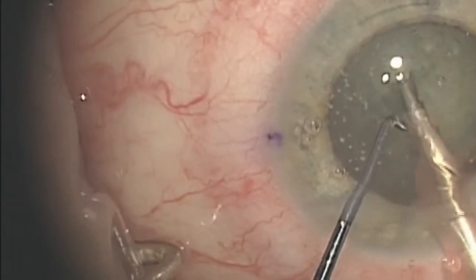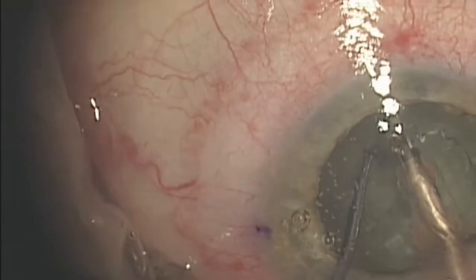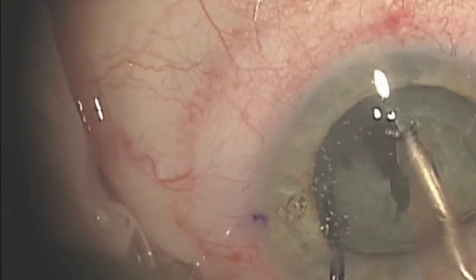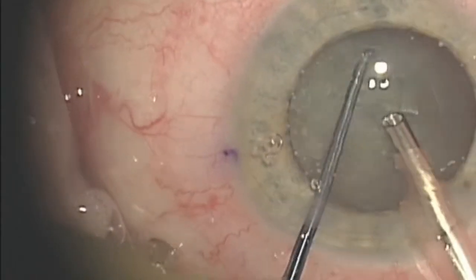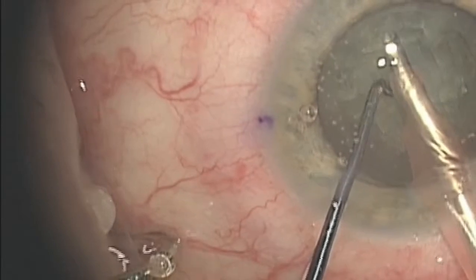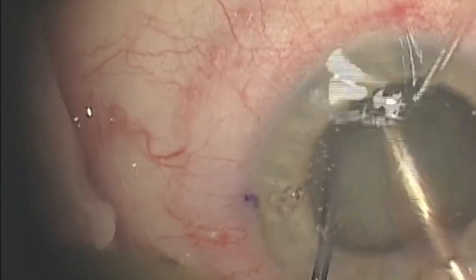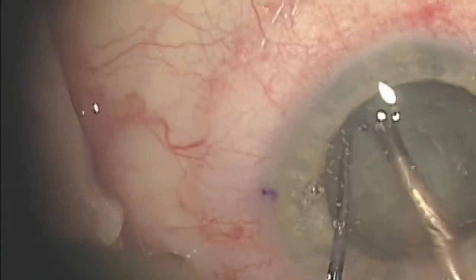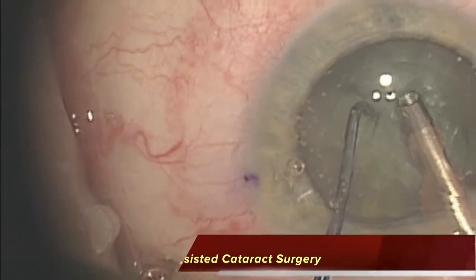We're going to spin that around. We're just going to go right in again. Crack it up like a little apple. Again. Now we've got a couple quarters. We'll do that one more time. Just spinning and turning it. We don't even have to hardly do any work because the laser does so much of the work for us now. I'll just get another good crack.